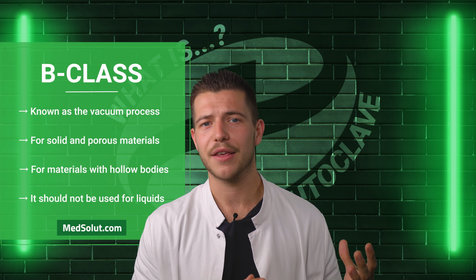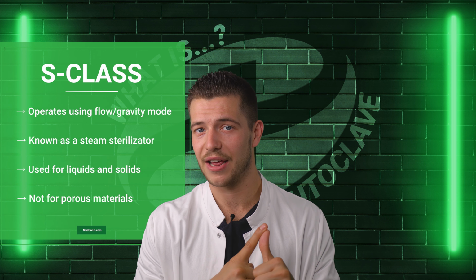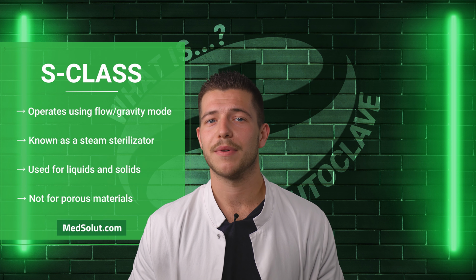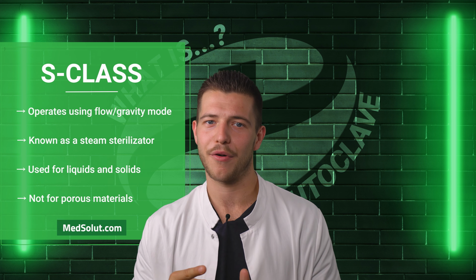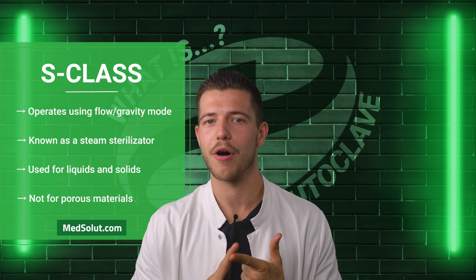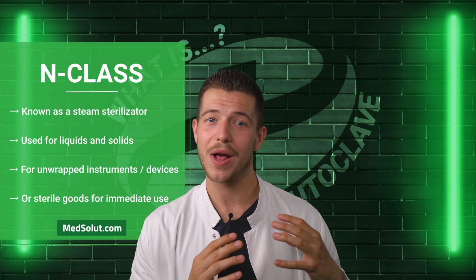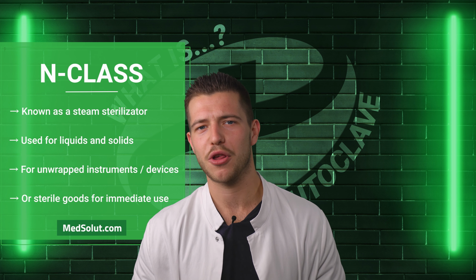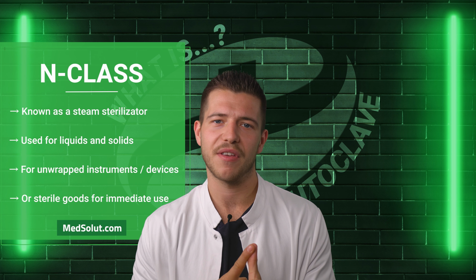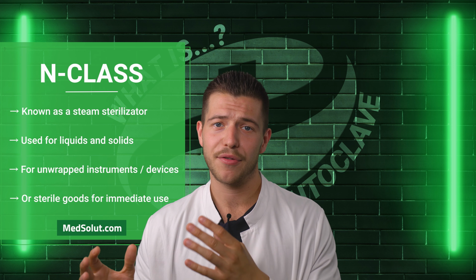Therefore, you could make use of a steam sterilizator like the S-Class autoclave, which is offering the possibility of treating solids and liquids, but not those offering porous materials or hollow bodies. The N-Class autoclave as well is a steam sterilizator, and of this one you could especially make use for unwrapped instruments, for materials for immediate use, and so on.